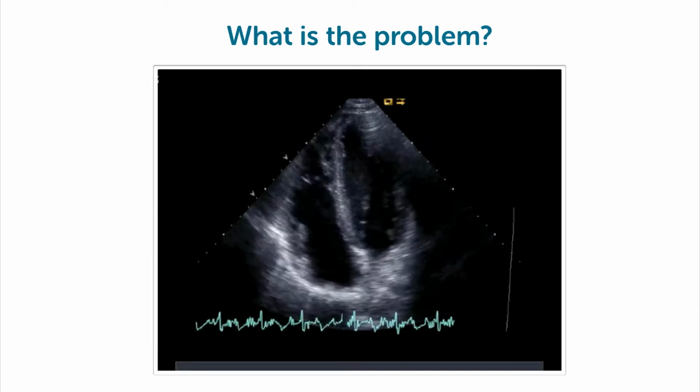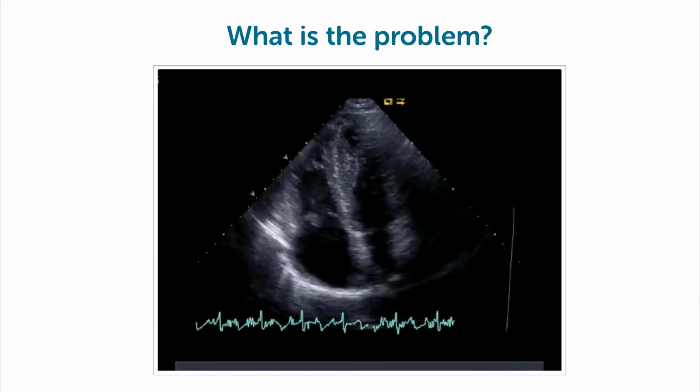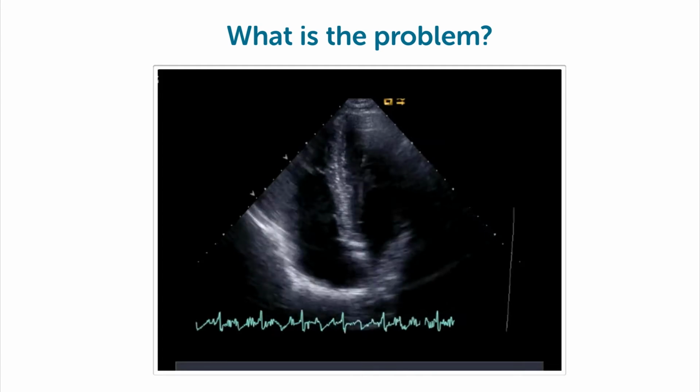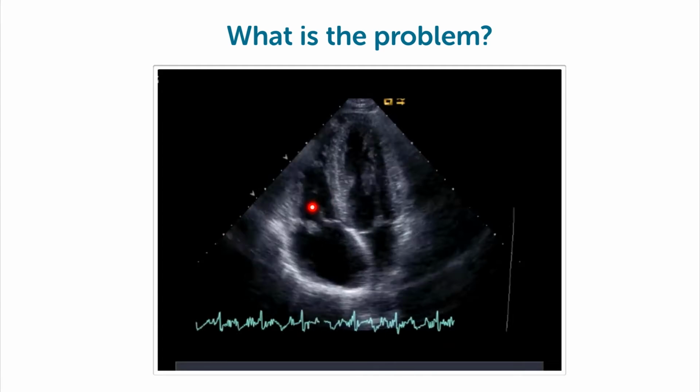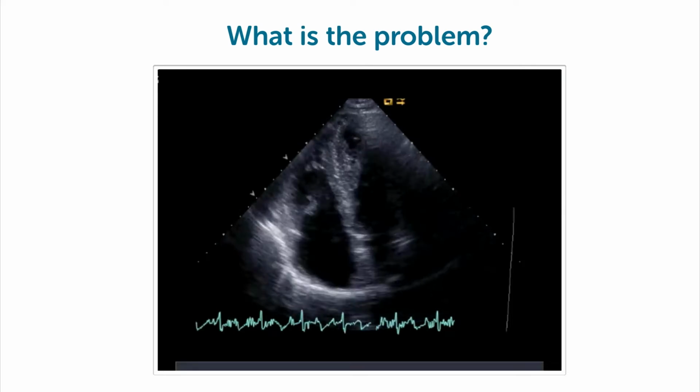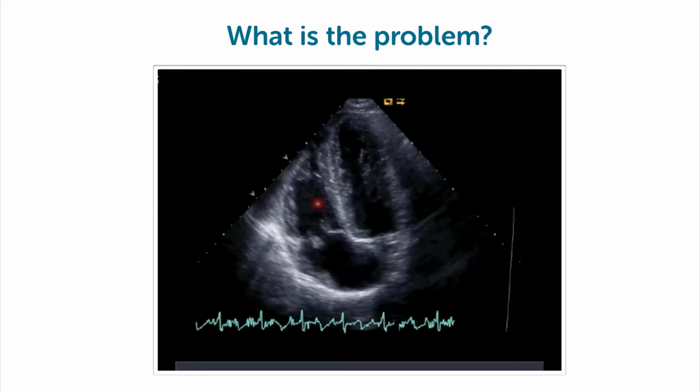This is actually one of the main problems we are confronted with now. Many patients now have pacemaker leads and they are at increased risk of vegetations, and something that certainly is a life-threatening disease as well. What do you think is the problem here? Take a look. Well, so you will probably remember left ventricle function is okay, but the right ventricle is dilated. The patient has a very high heart rate, and focus again on the tricuspid valve.